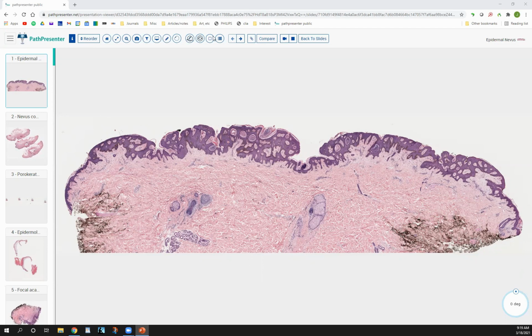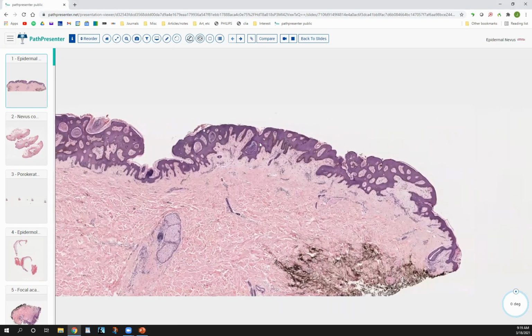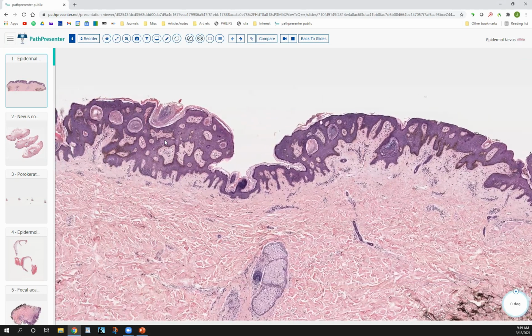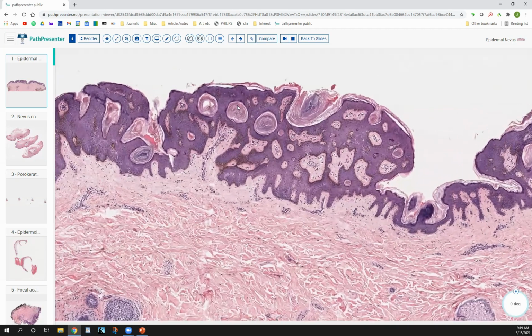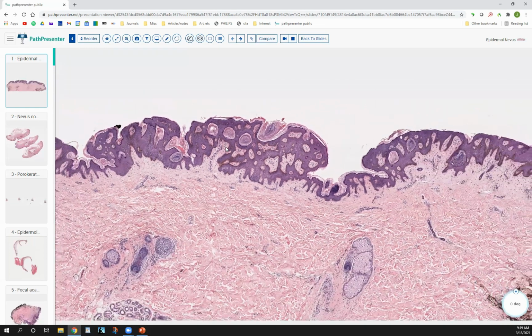And we can start with this interesting case, number one, which is a fairly broad biopsy. The things I see are quite a bit of papillomatosis here, some acanthosis of the epidermis, bland morphology to the cells. And practicing derm path daily, I would think this is pretty good for a seborrheic keratosis. We even have some horn cyst formation here. So what happens then? There's a couple of things.